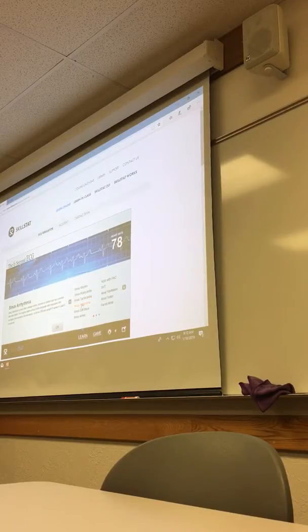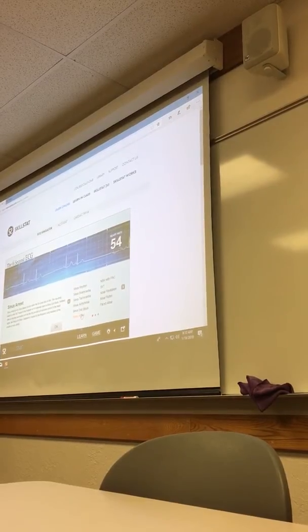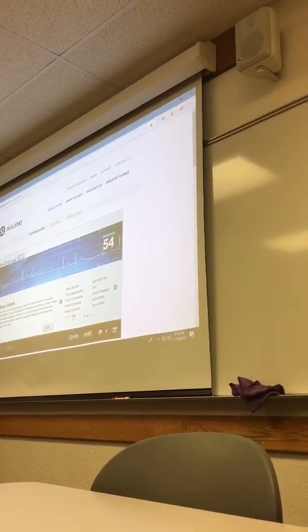Sinus arrhythmia, you can see the differences in breathing in, breathing out, breathing in, breathing out. You don't see this a lot on adults, but you can see this on children more. And then the block where your P waves are marching out, and so with both of these, it just didn't have an impulse, so we just skipped. There was a rest or block and nothing happened.